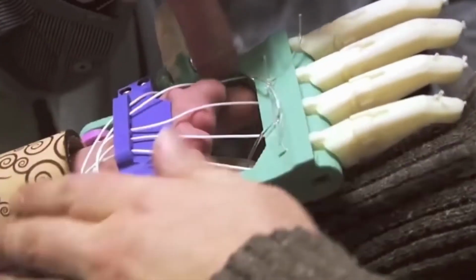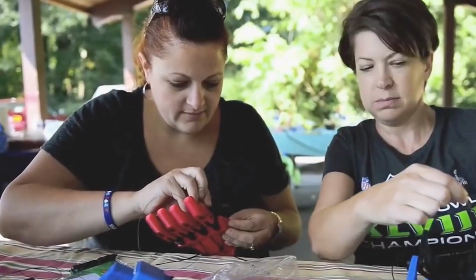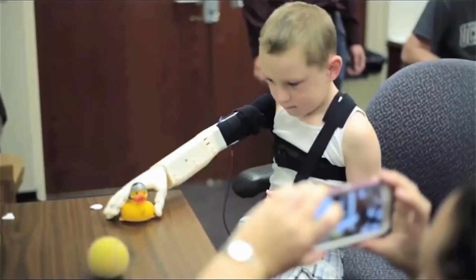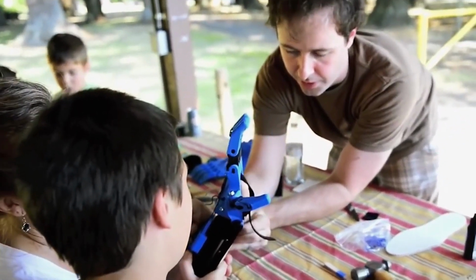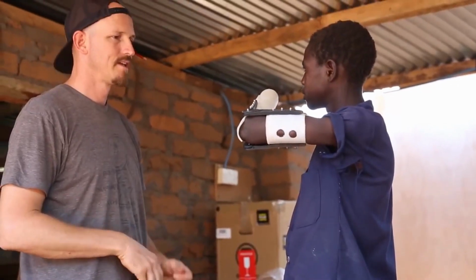Coming to the first chapter of this report, which is the introduction. Let's start with prosthesis. A prosthesis or prosthetic implant is an artificial device used in medicine to replace a missing bodily component that may have been lost due to accident, illness, or a birth defect. Prostheses are designed to replace the missing body part's lost functionality.